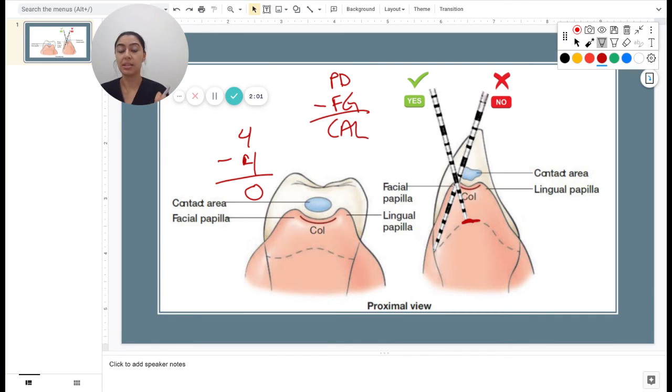We want to measure the attachment loss, and we want to measure all the FG margins accurately so we can stage and grade based on these attachment levels. Obviously, in this patient, it's a healthy periodontium. It's intact. It's only one tooth that I'm looking at, but in general, when we're looking at teeth like this and say the whole mouth has no attachment loss, we are looking at a healthy patient with intact periodontium is how we would state it in our diagnosis.